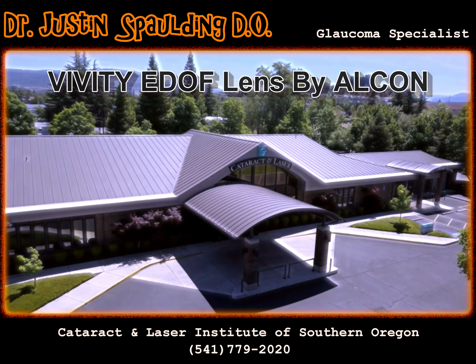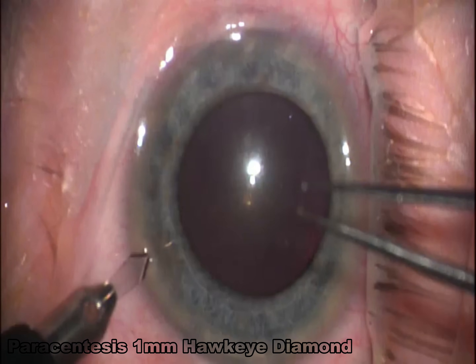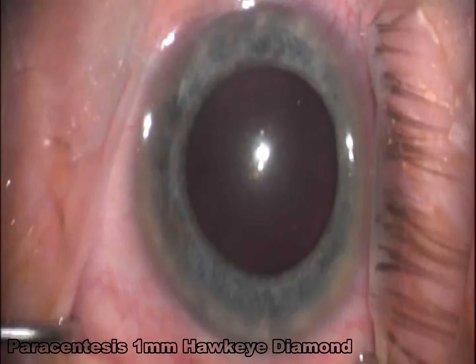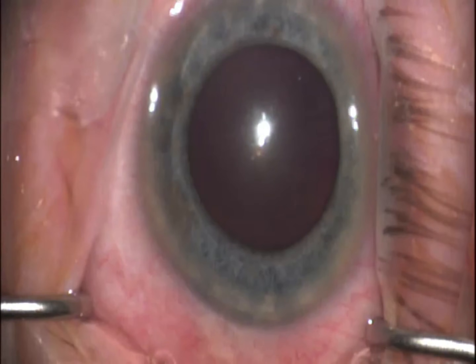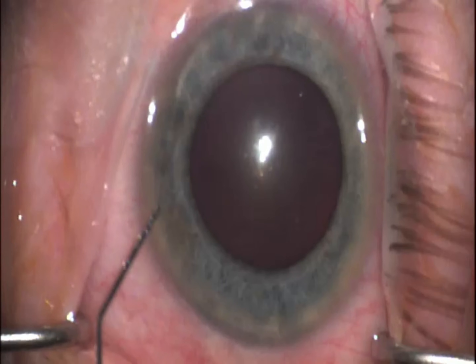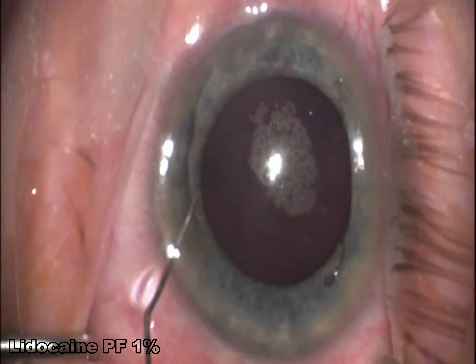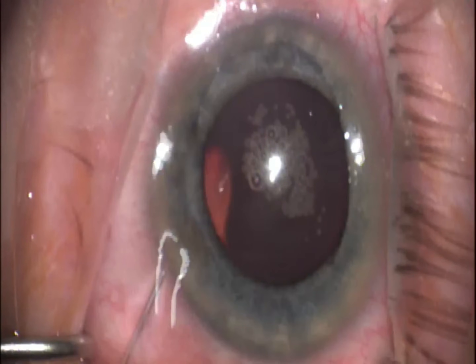This is an example of implantation of the new Vividi lens by Alcon. Here we're using a 1mm diamond blade to create our paracentesis wound. I like to inject preservative-free lidocaine on all my cases — it just helps the patient with comfort during the entire procedure, and it doesn't take a whole lot of time to do.